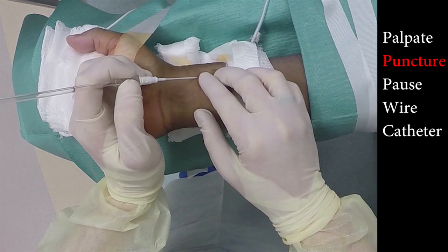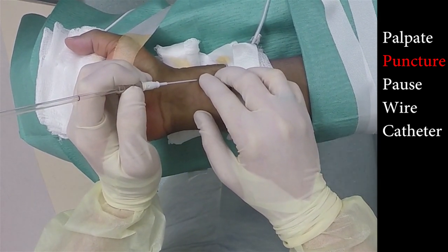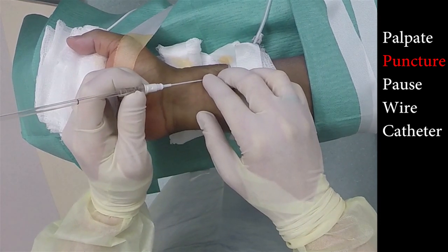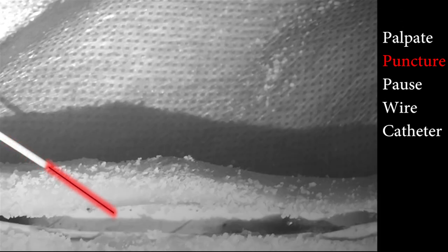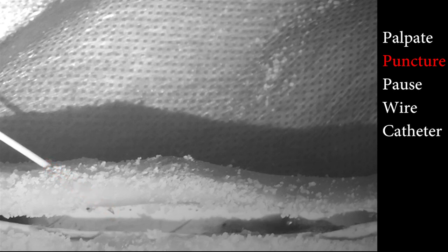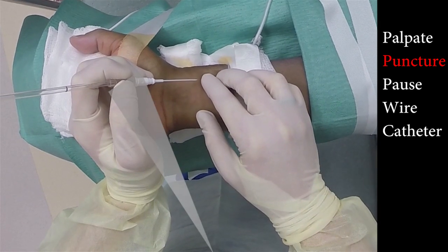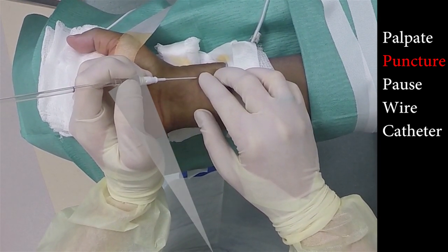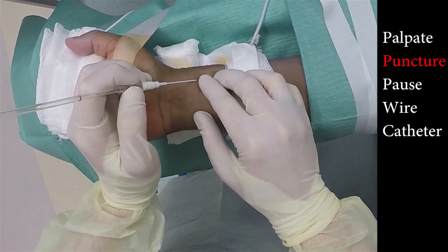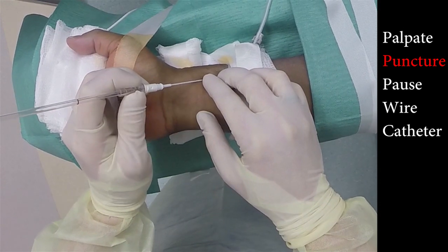Step two: puncture. Grip the Arrow with your thumb and index finger at the base of the catheter. Puncture the skin at 45 degrees using firm pressure to overcome the resistance of the skin. When using the Arrow kit for arterial puncture, you must constantly be focused on the piece of the catheter between your two fingers. This is the first area to fill with blood and will be your first indication that you have successfully punctured the artery.